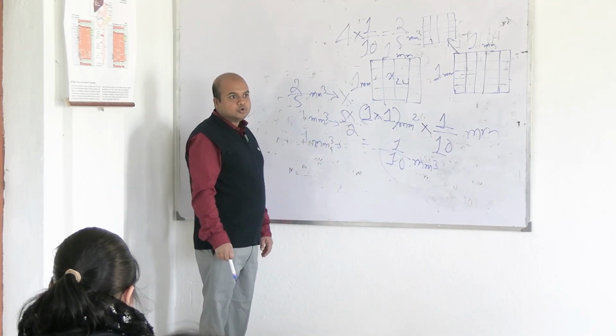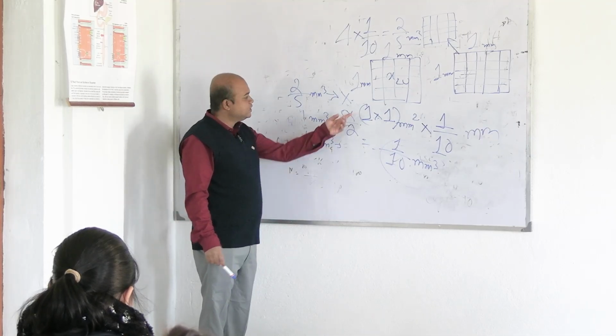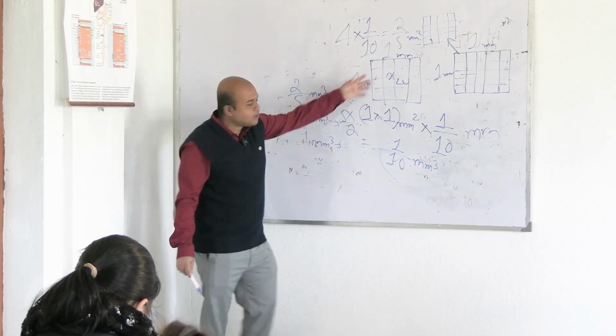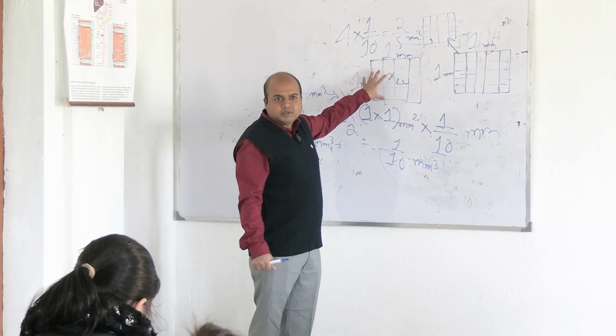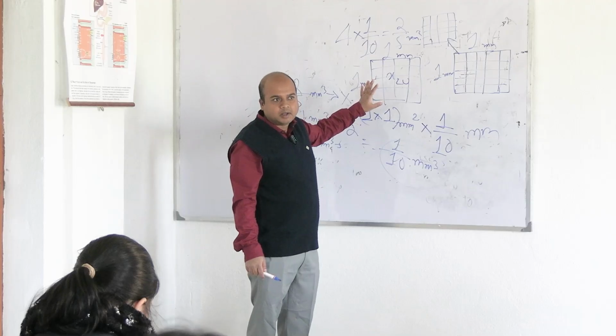Okay. So if we count without diluting blood, then what will happen? Actually this x will come more. This 5x/2 is the answer, so this x number of cells without diluting will be more. In the case of WBCs, maybe it won't be that congested, but still it will be congested without any type of dilution.